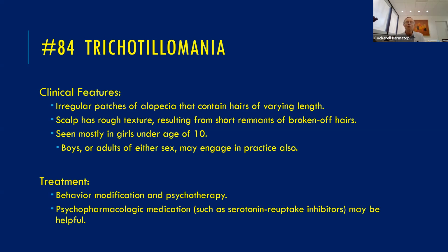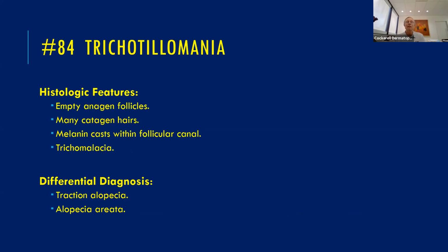But just make sure you understand the diagnostic features of trichotillomania: the trichomalacia, the fractures, the damage to the actual hair shafts, and variable amounts of inflammation. Sometimes there can be a lot, sometimes there can be almost none.